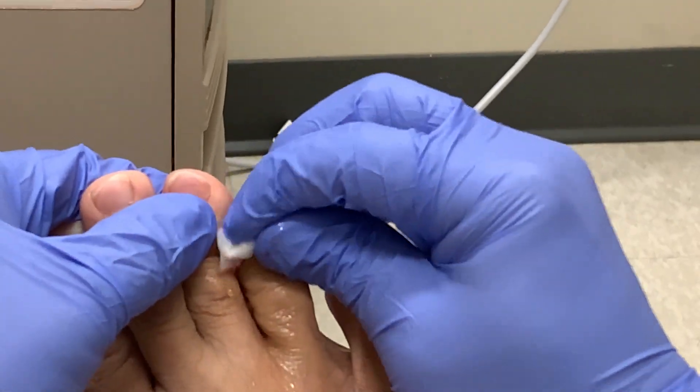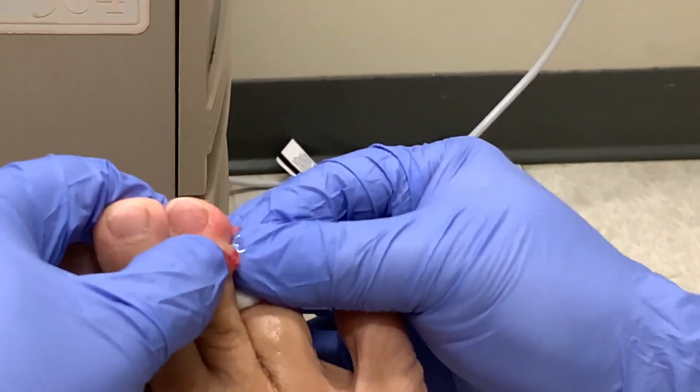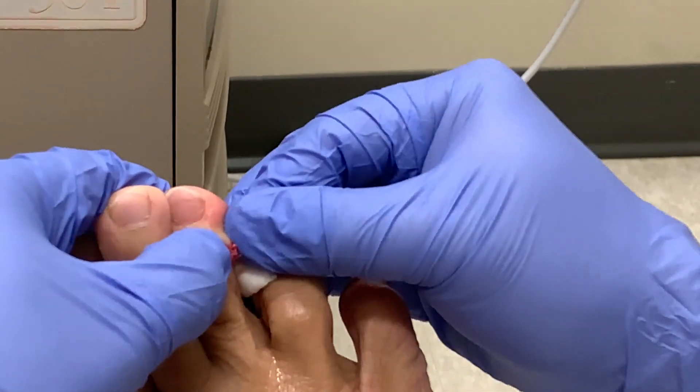It proceeds to drain the rest of the fluid and leave an empty sack. Now we're left with an empty sack, and then hopefully that sack will collapse. The doctor says he'll put a little bit of a pressure dressing on it.